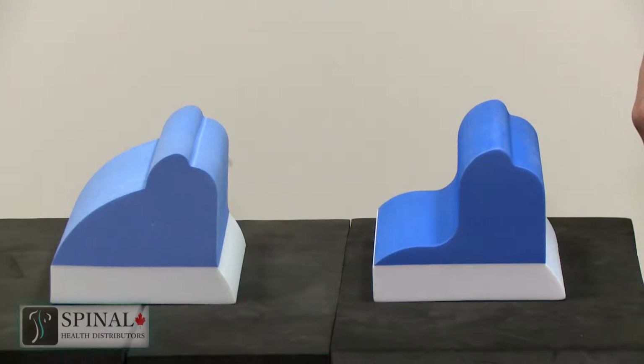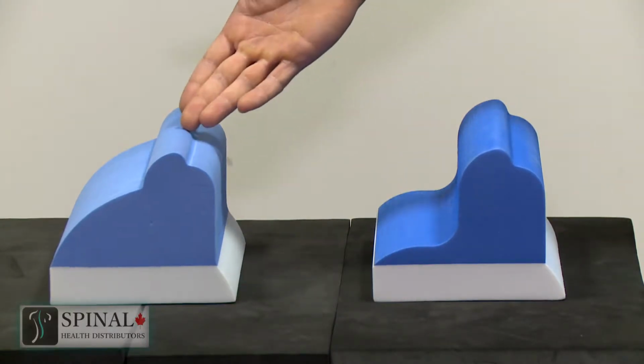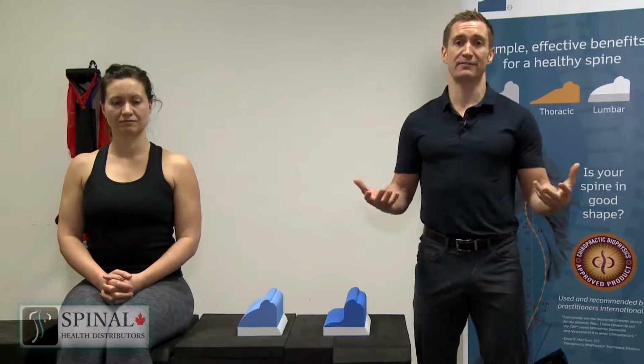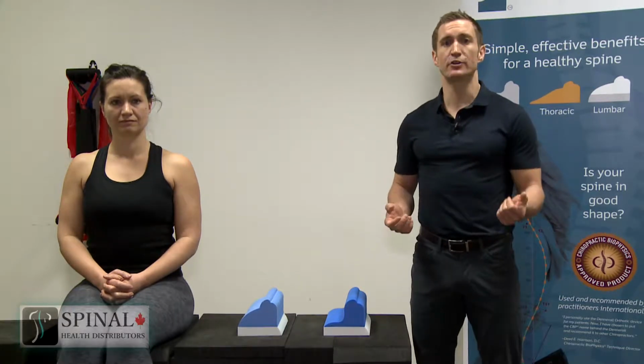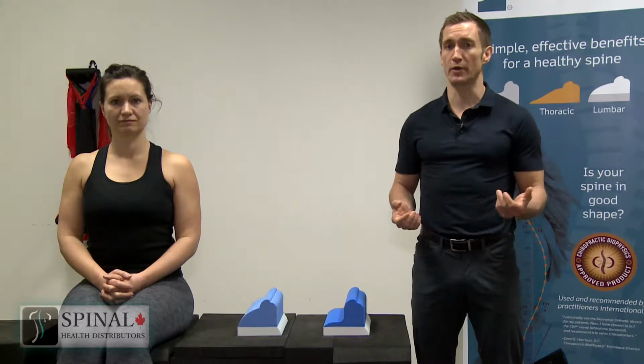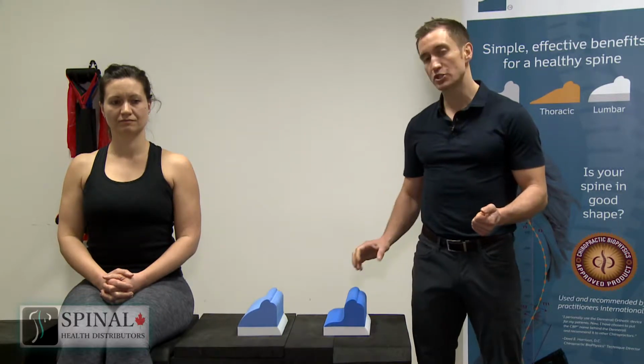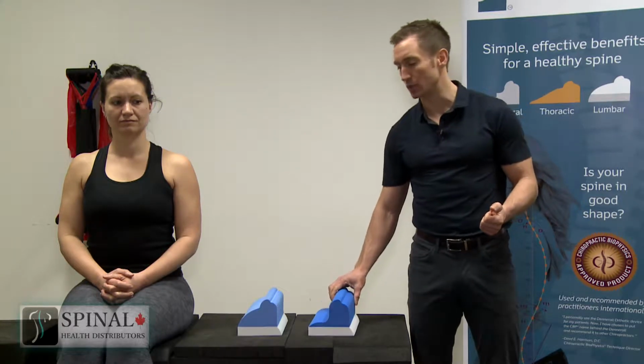There are two types of Scoliroll. There's the lumbar Scoliroll and the thoracic Scoliroll. Now, indications are obviously the patient having scoliosis, so 10 degrees of lateral curvature with rotation as seen on X-ray. So let's go ahead and start by demonstrating the lumbar Scoliroll.